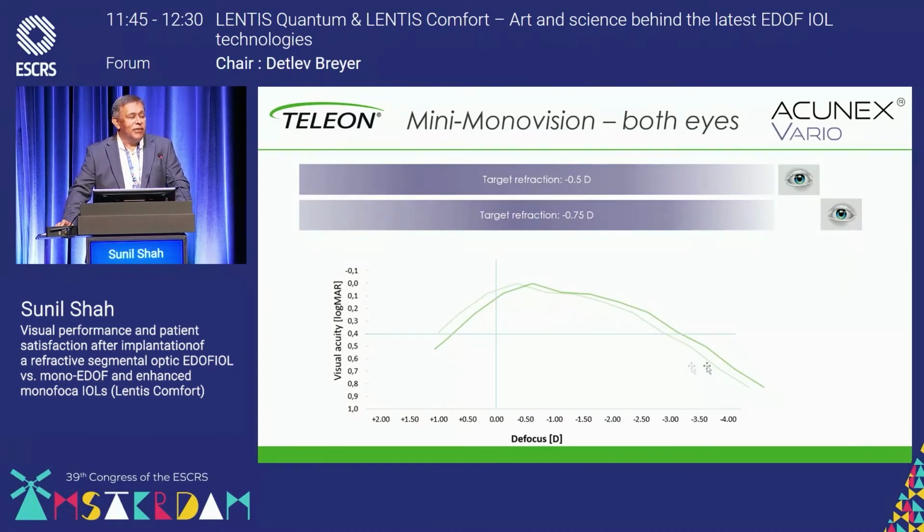Maybe if they did drive, you pop on some driving glasses, but probably they don't need it. But actually your near vision is pretty good. And remember, all the way through, you've got seamless transition of vision. So you will cover everything in between your distance and your near.